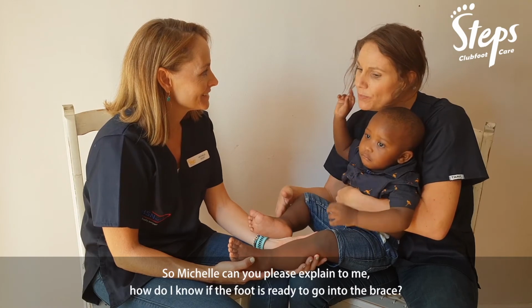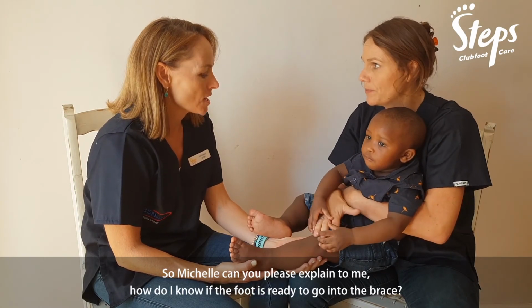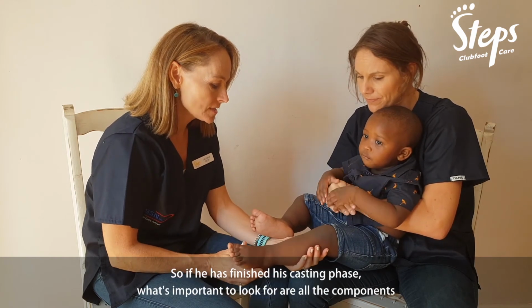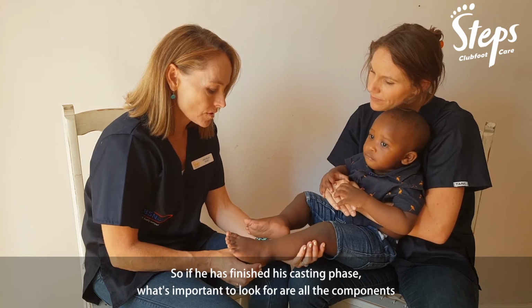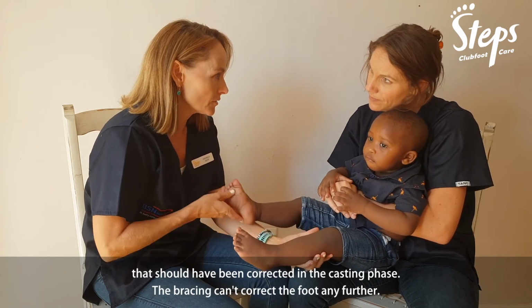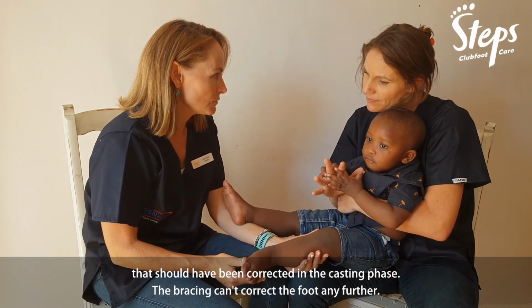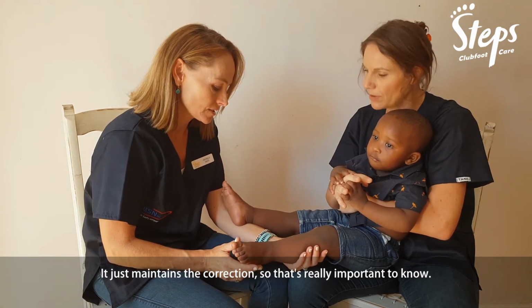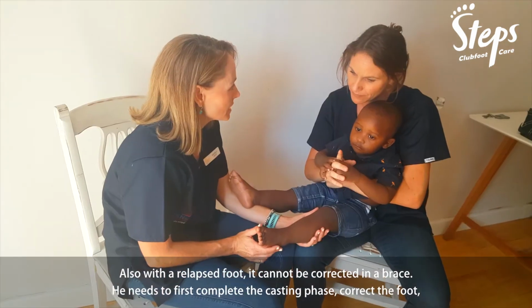So Michelle, can you please explain to me, how do I know when the foot is ready to go into the brace? Okay, so if he has finished his casting phase, what's important to look for are all the components that should have been corrected in the casting phase. The bracing cannot correct the foot any further, it just maintains the correction. So that's really important to know. Also, a relapsed foot cannot be corrected in a brace.